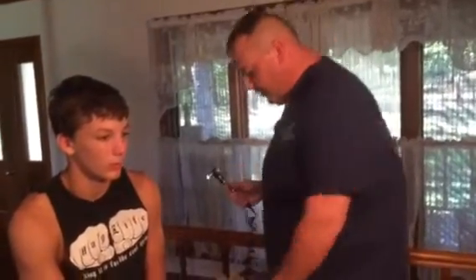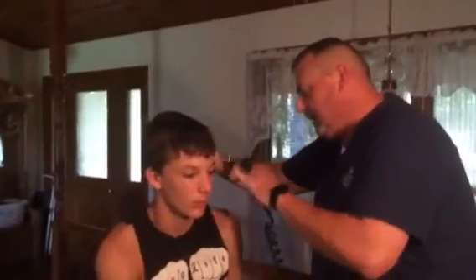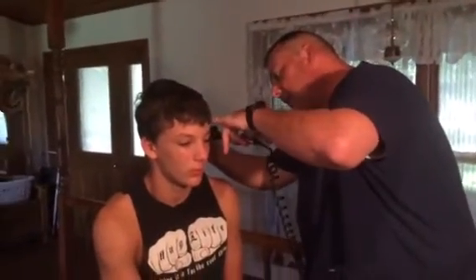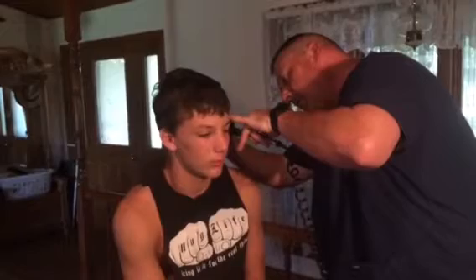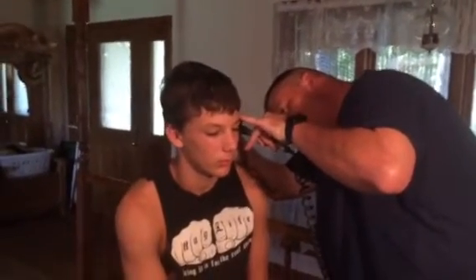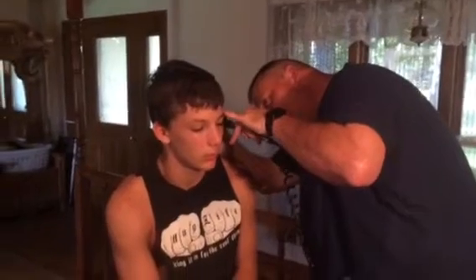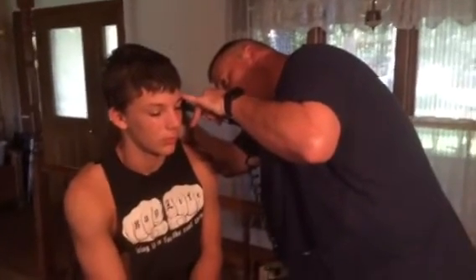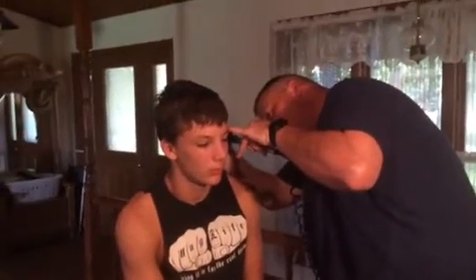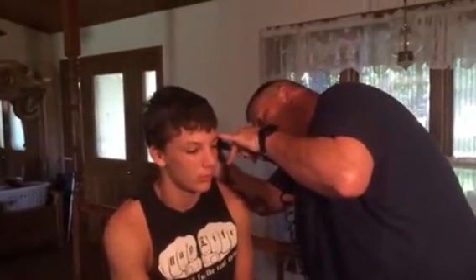On children 3 years or younger, you want to pull down and back. Older than that, adults, you want to pull up and back. Place your hand against the forehead. And you want to look for the tympanic membrane. Make sure that it's pearly white, clear, no drainage, no inflammation. That could be the signs of infection.